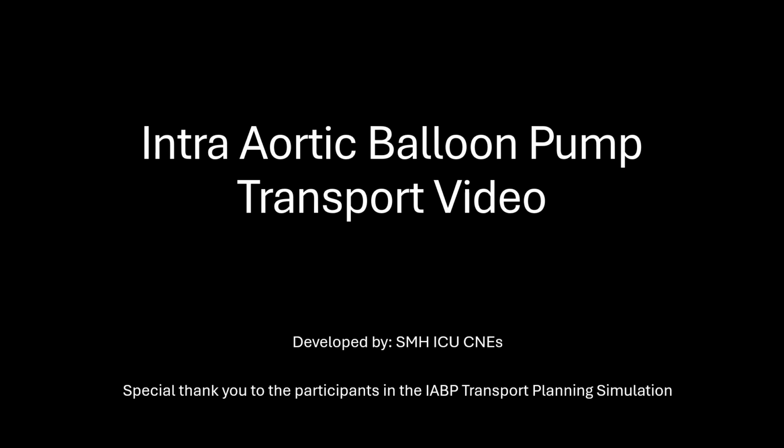This is the intra-aortic balloon pump transport simulation video intended to help staff view what these transports are like. Please refer to the most recent intra-aortic balloon pump transport quick guide for complete guidelines.